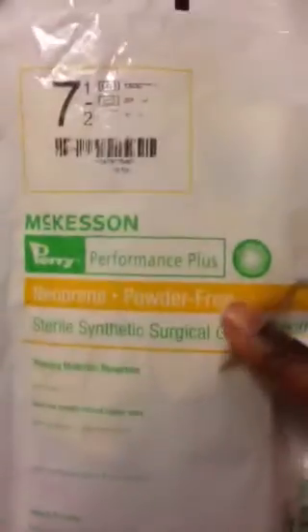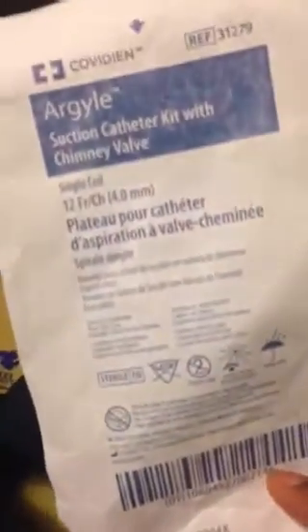You get sterile gloves. You can use this to do the trach care and also for the Foley, and you get measured for this when you get your bag. So you get one sterile glove, and you get a suctioning kit for suctioning trachs. It's in there. Mine is already open, like I said, because I used it already. So here's your kit. Yours is probably going to look nicer because it won't be opened. So yeah, suctioning kit.